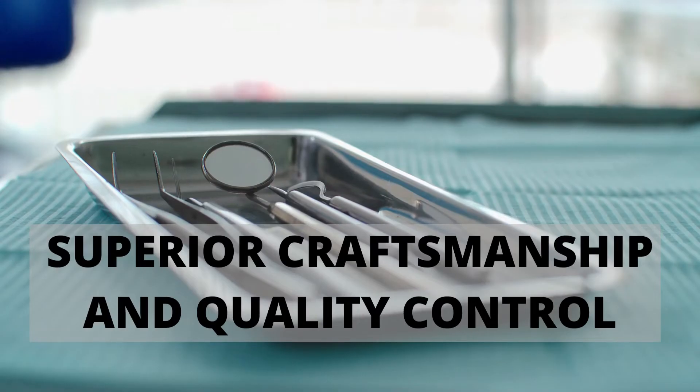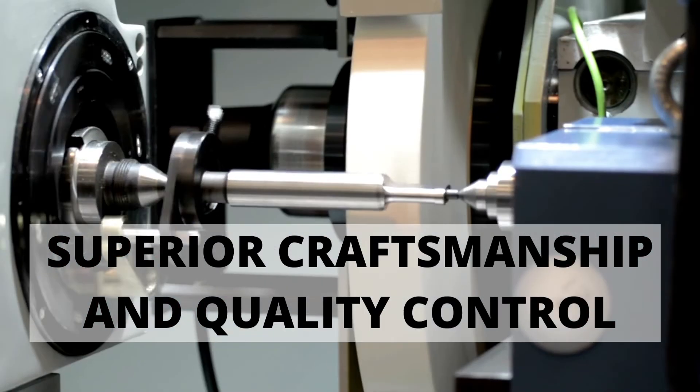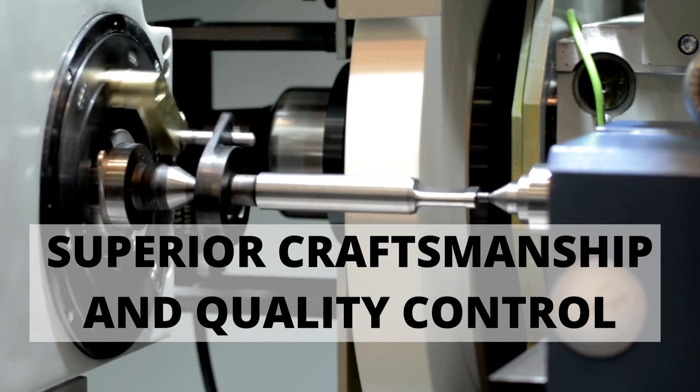This is a high-quality stainless steel instrument made from surgical-grade stainless steel and is handcrafted by highly trained instrument makers. The instrument is then surface-treated to give it a matte finish.